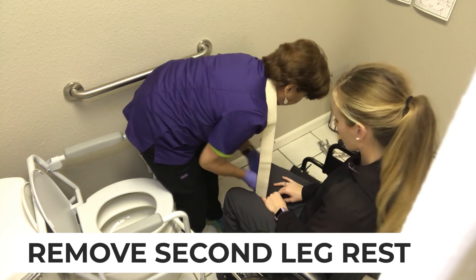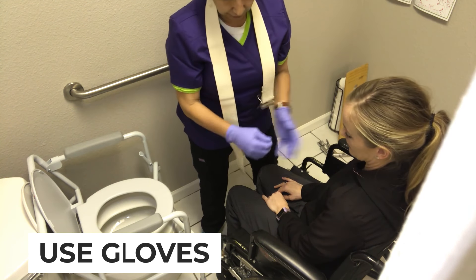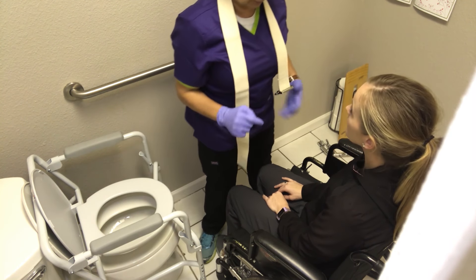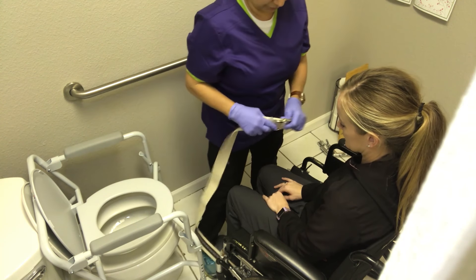Take the other footrest off. I'm going to have gloves on because gloves are always easier and cleaner when you're going to be in the bathroom with someone. You can buy the boxes really cheap at Sam's or Walmart or somewhere.